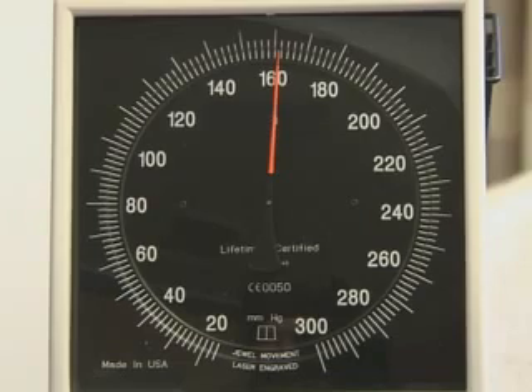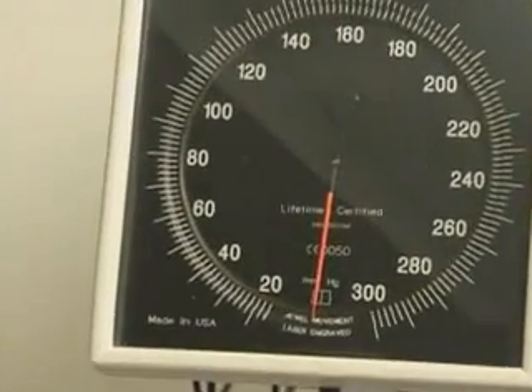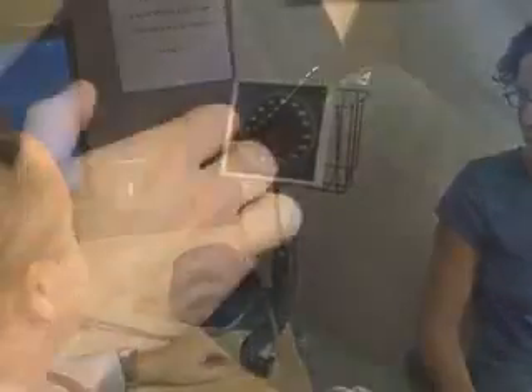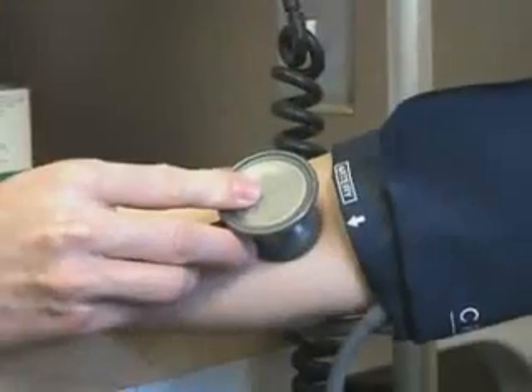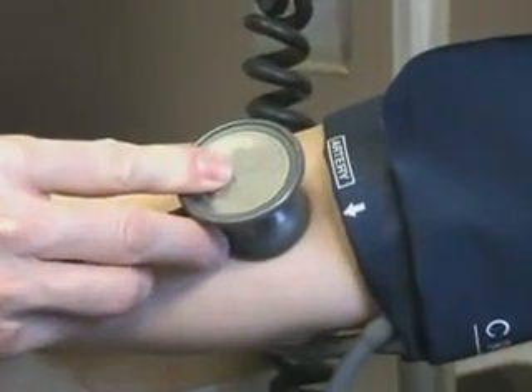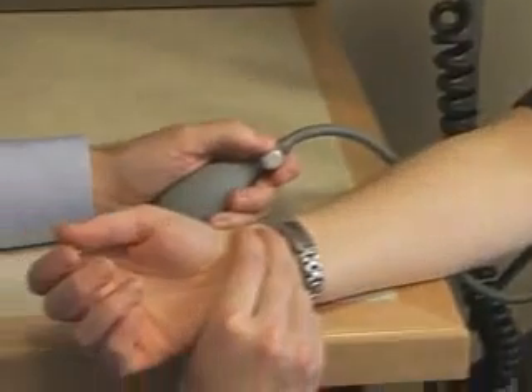Certain conditions may complicate blood pressure measurement or interpretation. In such settings, decreasing the rate of deflation and averaging several readings may improve accuracy. Observer bias is usually the most common error that occurs in blood pressure measurements. It occurs because practitioners often show digit preference and rounding of the terminal digit. When two people use the same correct technique for measuring blood pressure, there should be little inter-observer variation. Measuring blood pressure correctly is required to classify individuals, to stratify their cardiovascular risk, and to monitor the effects of treatment.